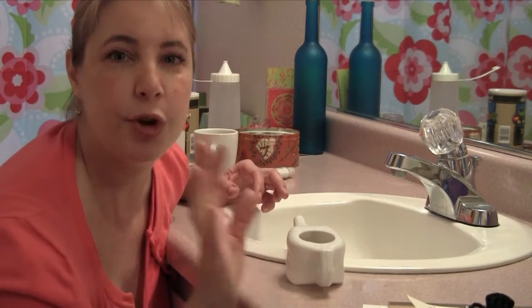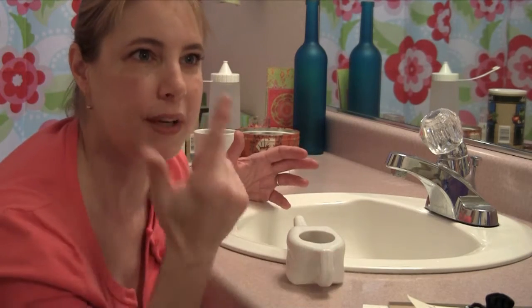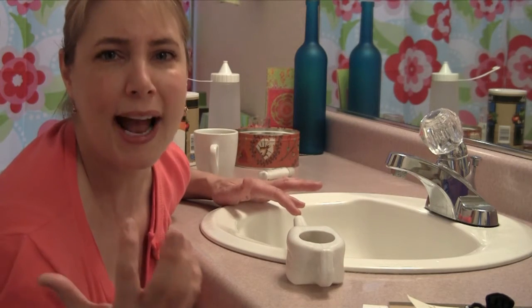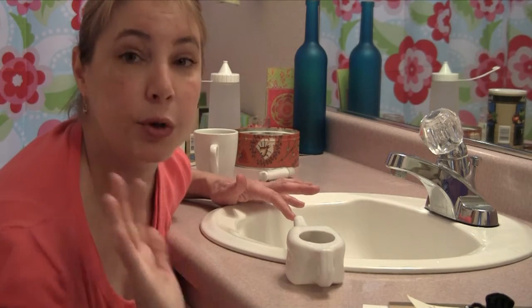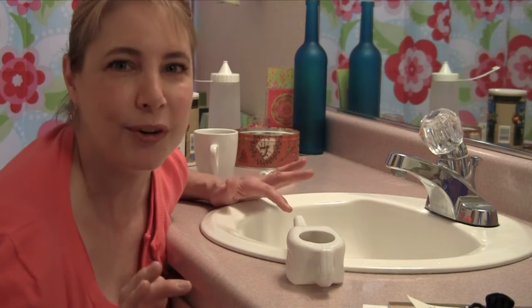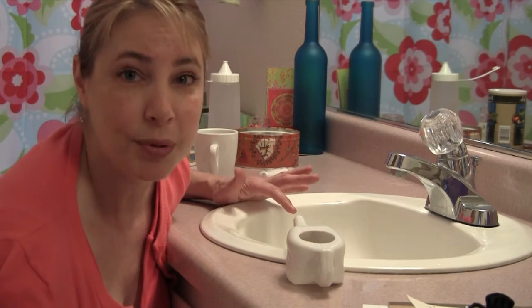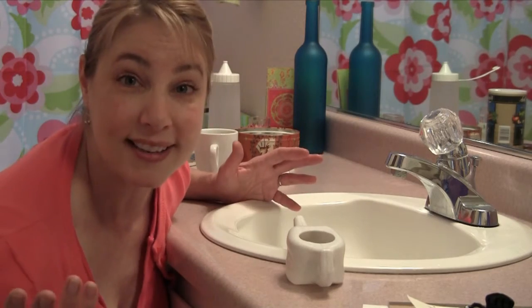Here's the trick. Don't freak out, you're not going to drown. What happens is people think that they put something up their nose and it's going to go in their lungs. Come on, we're not two. Your body is versed at how to shut off the lungs from moisture. But here's the easiest trick if you want to be a co-partner in your own lung comfort. You just breathe in before you start and you exhale as you pour, okay? Really easy. So here we go.